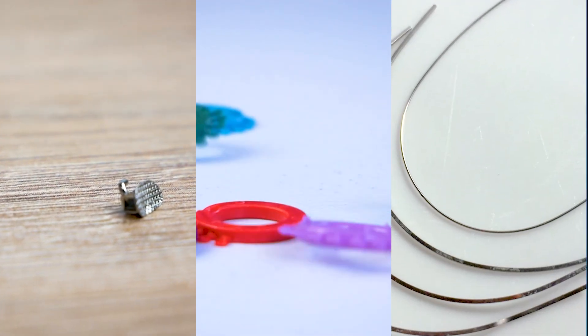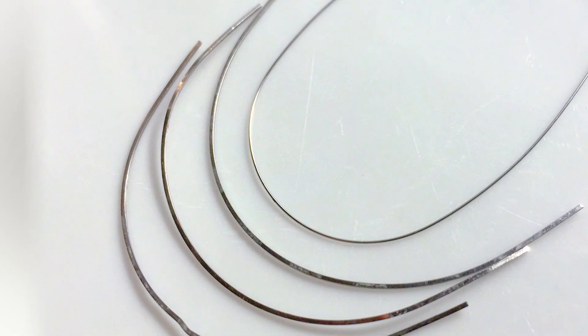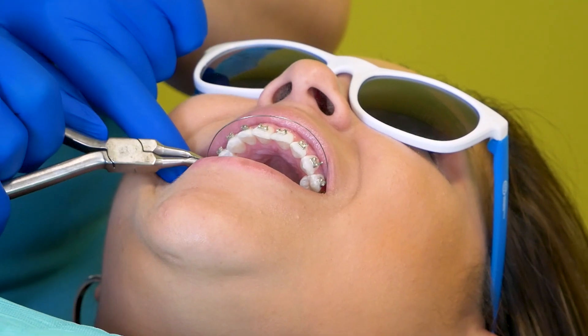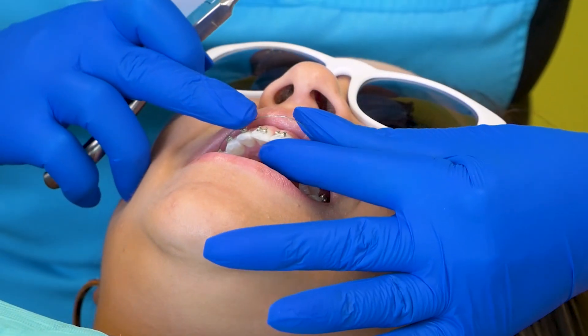Braces consist of several components, including brackets, bands, and arch wires. Arch wires, which are the focus of today's discussion, are the framework that connects the brackets, applying gentle pressure to guide your teeth into their correct positions.